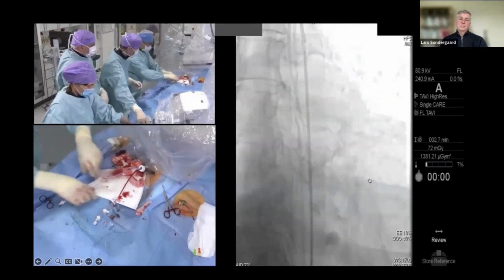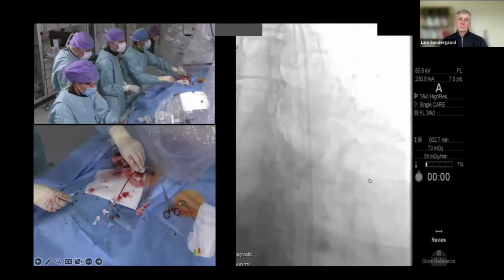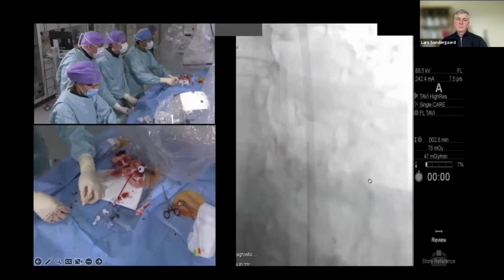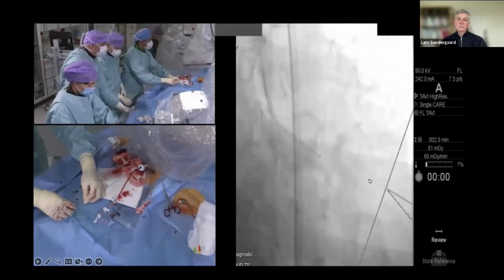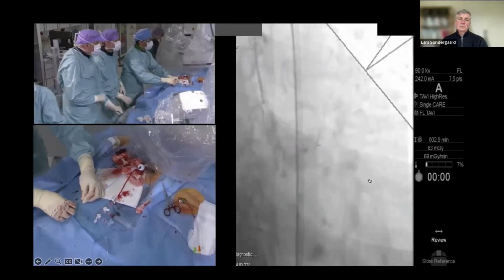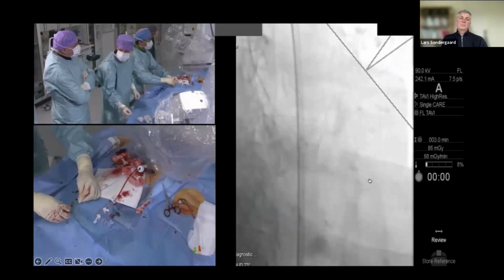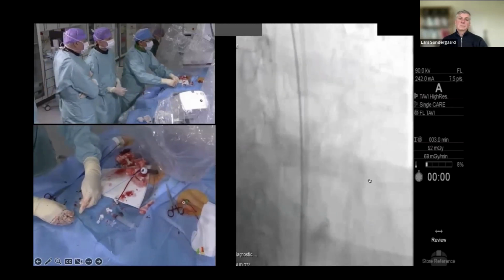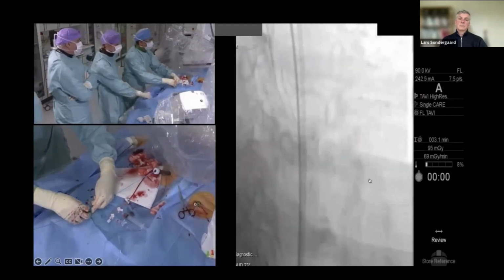So next will be to cross the valve. Gintas has got an AL1 catheter with a standard straight wire. Working in, one of the things we're doing as a routine now when we cross the valve is to start in a right-to-left cusp overlap view. So can you explain why that's an advantage?